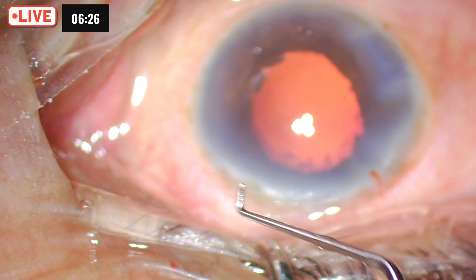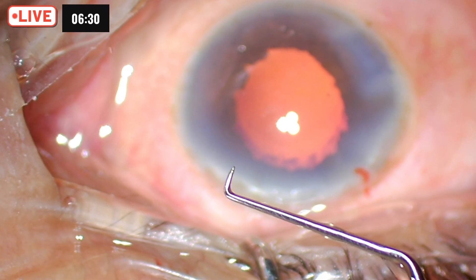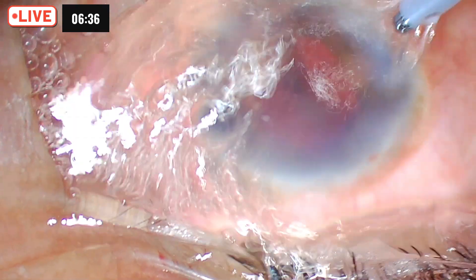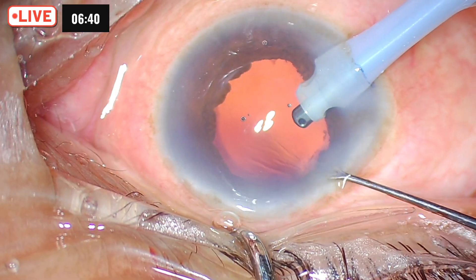Once again pointing out the special feature of this chopper: it is a very long chopper with only a sharp cutting tip, but the edges are rounded. We just try and clean up any residual cortical matter and the surgery is over.